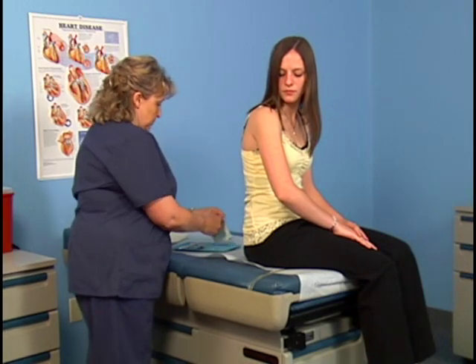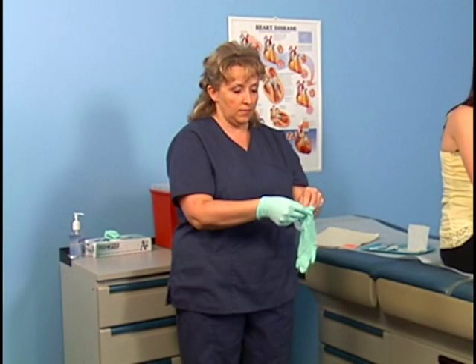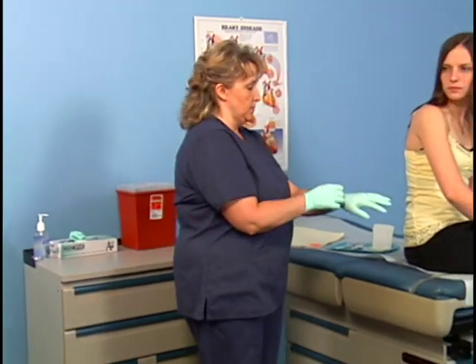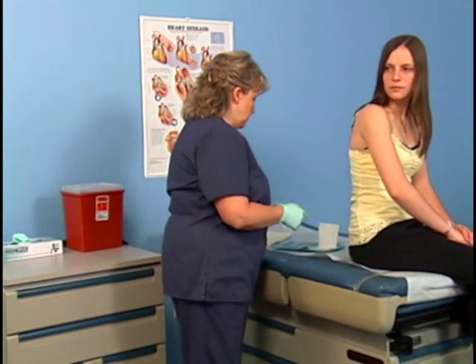Do not touch the site after cleansing it, otherwise you will need to repeat the cleansing process. Allow the area to dry completely, otherwise the wet antiseptic may enter the tissues when the skin is pierced, resulting in irritation and patient discomfort. Apply gloves to protect yourself from blood-borne pathogens. Remove the needle guard.